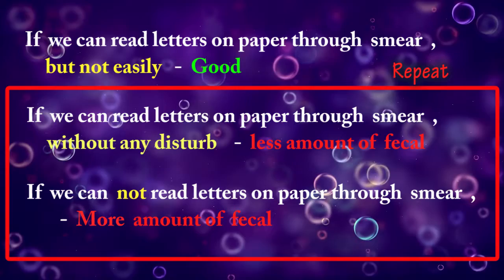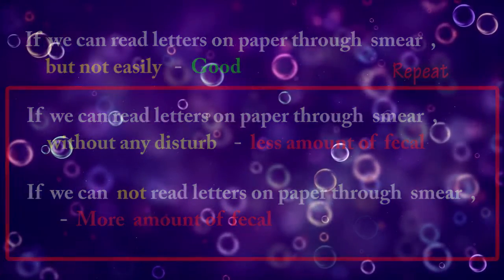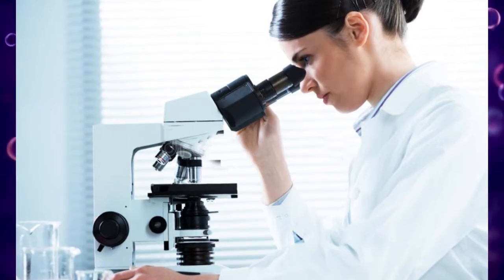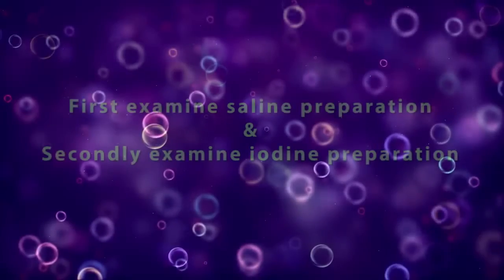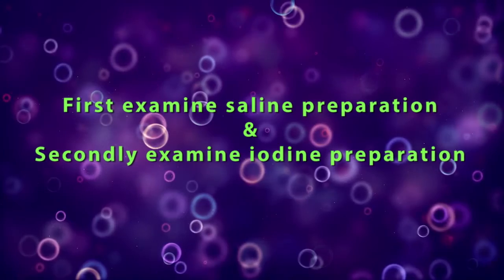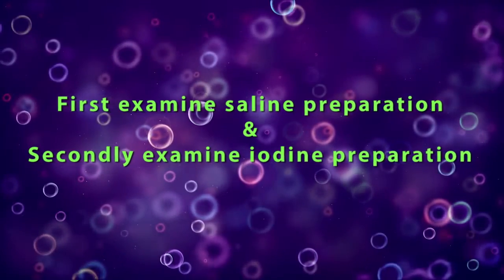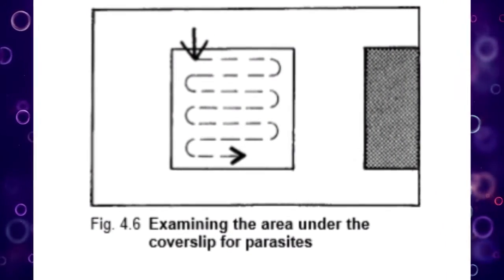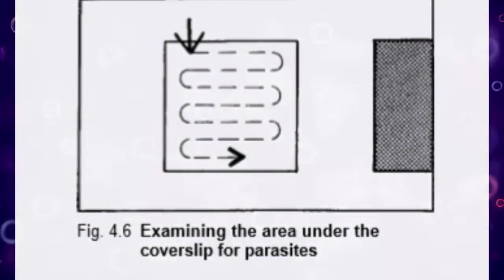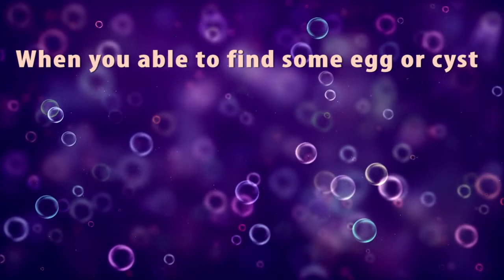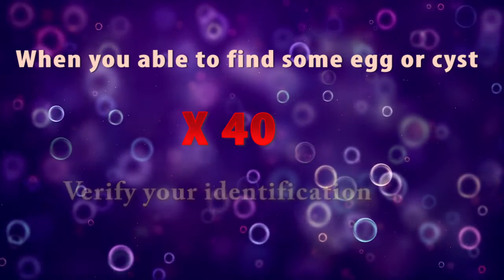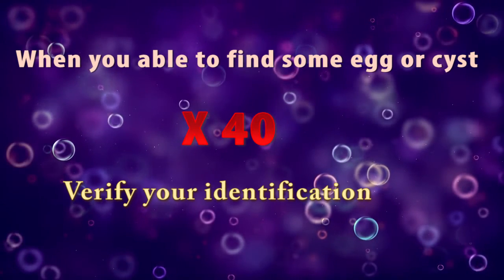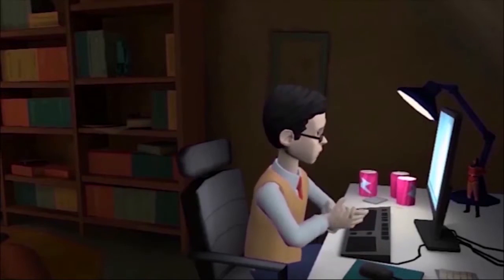In both cases we have to repeat the slide preparation. The next step is to examine the preparations under the microscope. We should first examine the saline preparation and secondly examine the iodine preparation. Start at the top left-hand corner on the edge of the coverslip using the 10x objective. When you are able to find some egg or cyst, switch to the 40x objective and verify your identification.